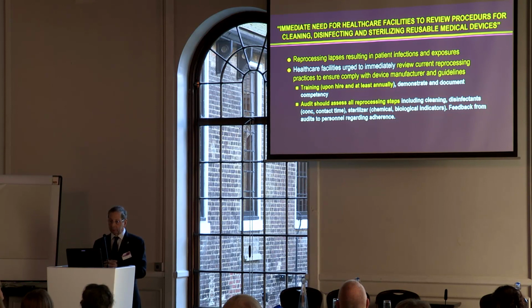Now, in terms of endoscopes, we need to say reprocessing lapses are resulting in patients' infections and exposures, and there's an immediate need for healthcare facilities to review their procedures for cleaning, disinfection, and sterilization. This was from CDC and FDA: healthcare facilities are urged immediately to review current reprocessing practices to ensure compliance with device manufacturers' instructions and guidelines.